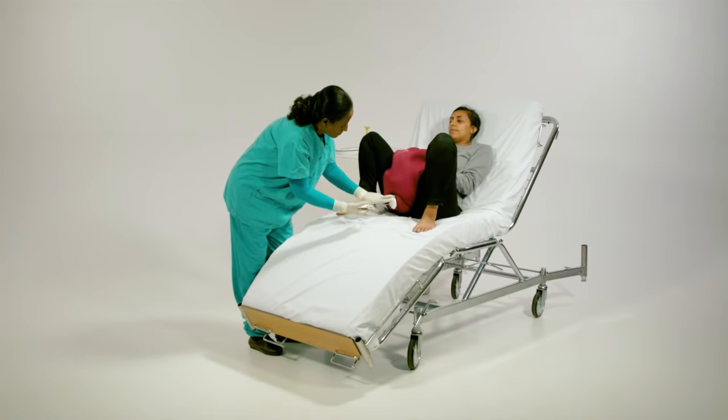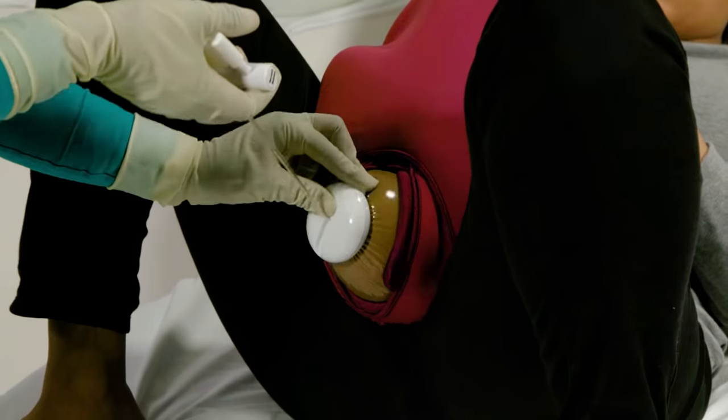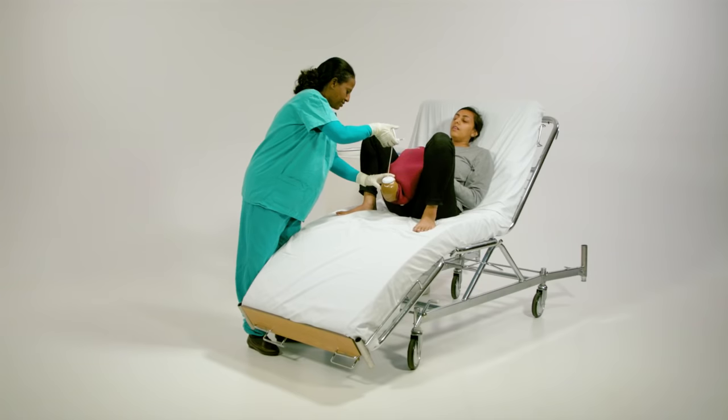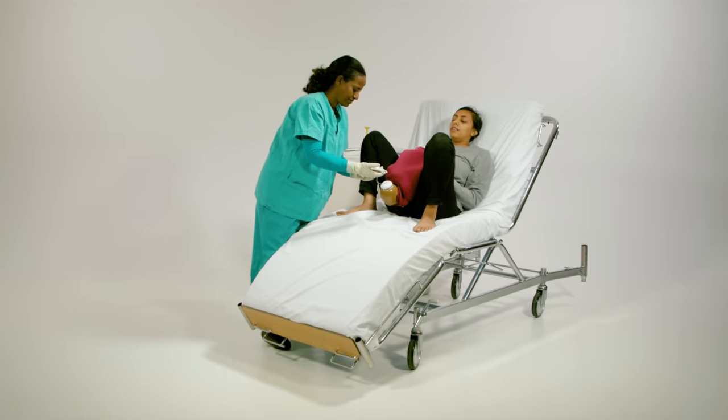Wait for the contraction and apply downward and outward traction to deliver the head. Apply traction in a line perpendicular to the plane of the cup rim. This can be repeated with contractions two to three times as needed.